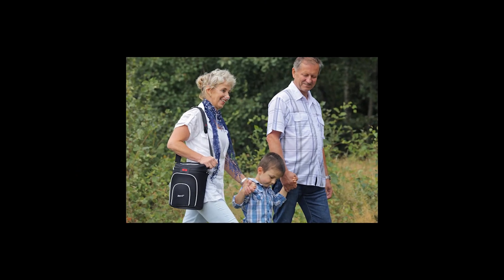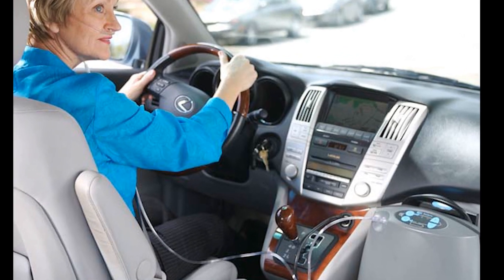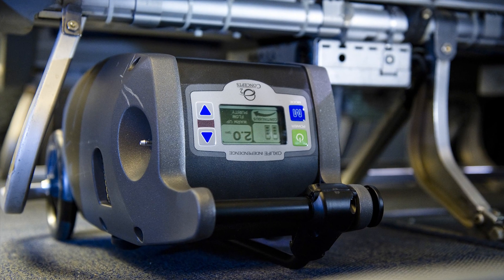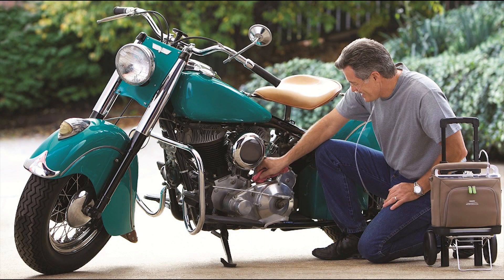The air that the patient receives is roughly 90 to 95% pure oxygen — such a simple concept that's brought freedom and independence to so many. Portable oxygen concentrators are safe and convenient for car travel, and are approved by the FAA for in-flight use. They also fit easily in the authorized storage areas. Don't let a need for medical oxygen hold you back from doing all the things you love to do.